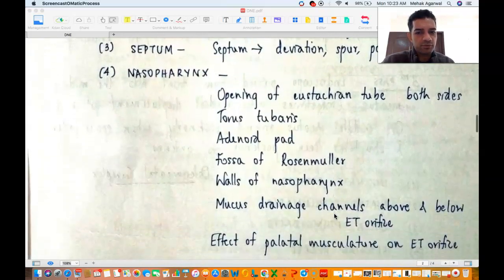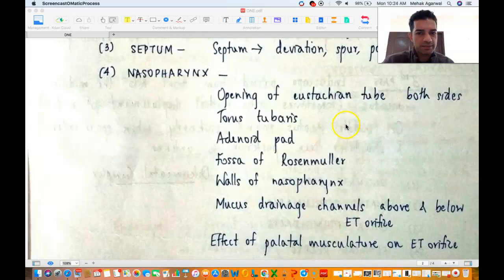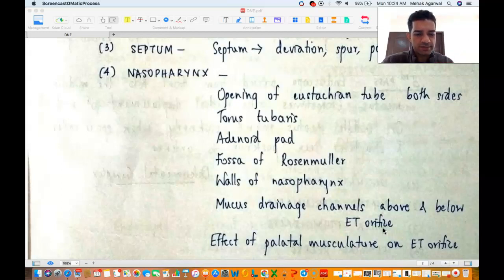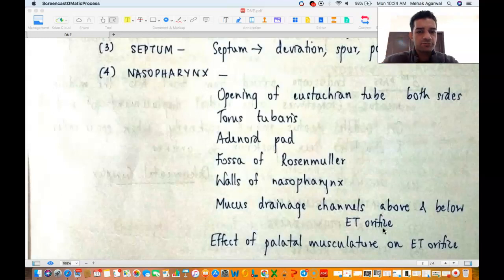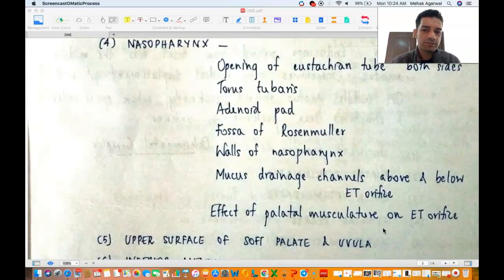Then you see the nasopharynx: the Eustachian tube opening on both sides (even though you insert from one side, once you reach the nasopharynx you can see both openings), the torus tubaris, the adenoid pad, the fossa of Rosenmüller which is behind the Eustachian tube orifice, the walls of the nasopharynx including lateral walls, soft palate (inferior wall), roof and posterior wall. You also see the mucus drainage channels above and below the Eustachian tube orifice — anterior sinuses drain below the orifice and posterior sinuses drain above — and the effect of palatal musculature on the ET orifice when you ask the patient to swallow.